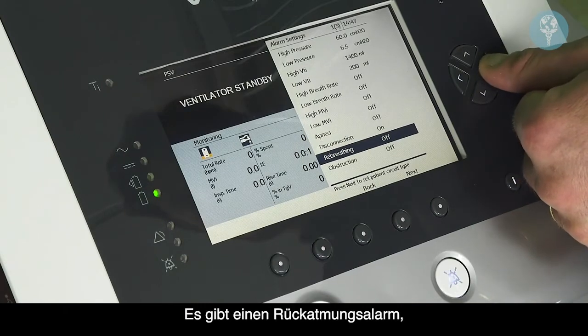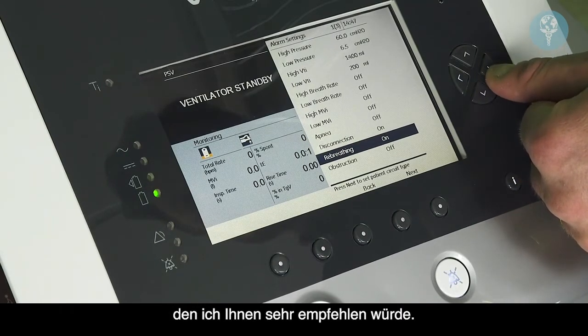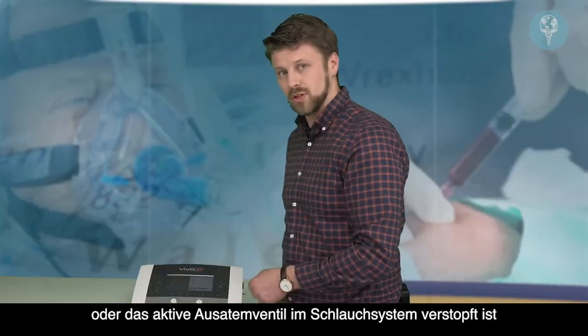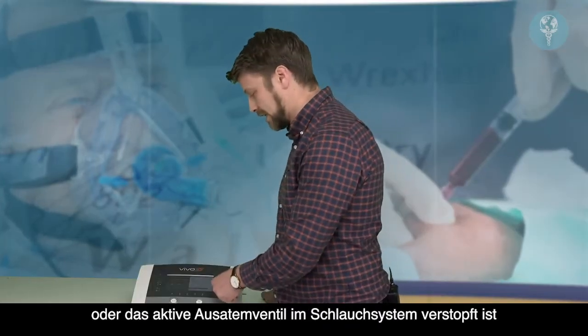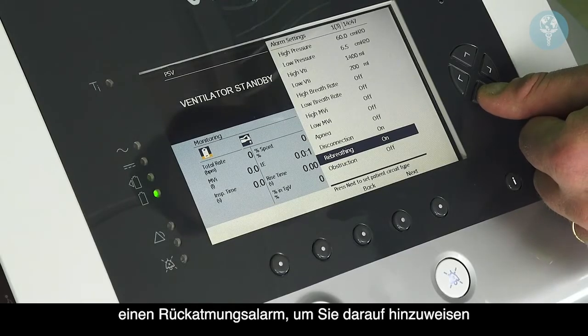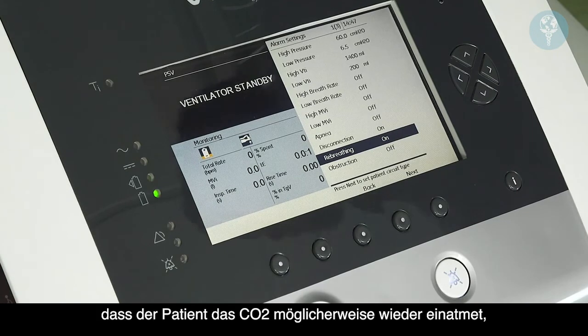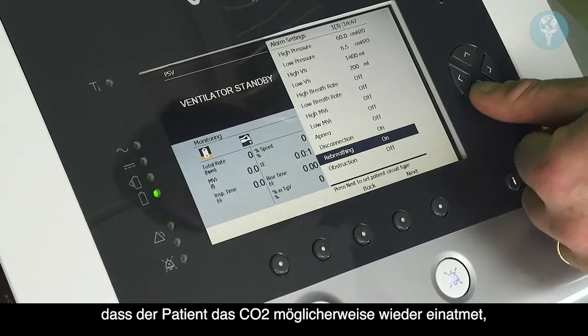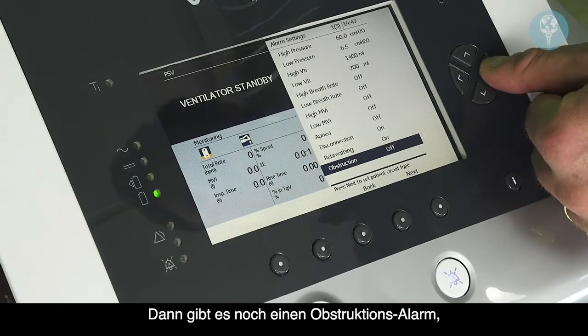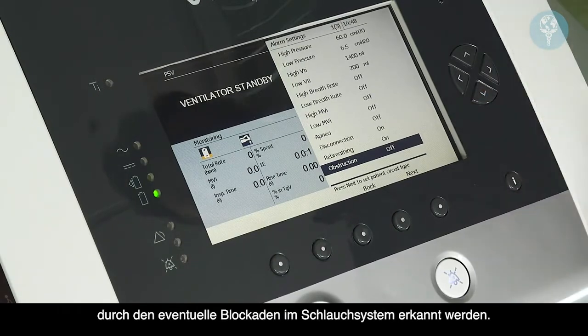You have a rebreathing alarm, which I would advise you set to on. In this situation, where either the leakage port or the active valve in the circuit has become obstructed or is not functioning properly, the rebreathing alarm lets you know that the patient is potentially rebreathing the CO2 that they're expiring. You also have an obstruction alarm, which will detect any blockages in the circuit.